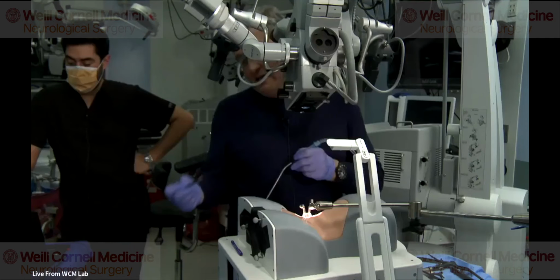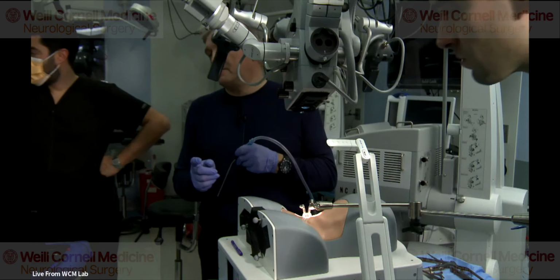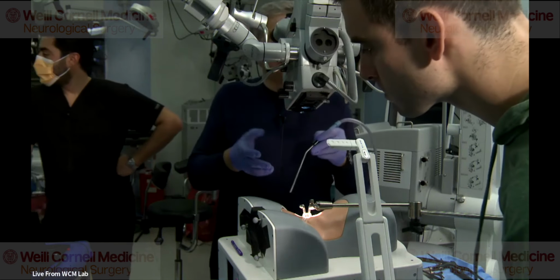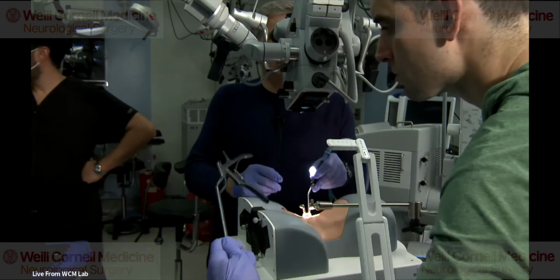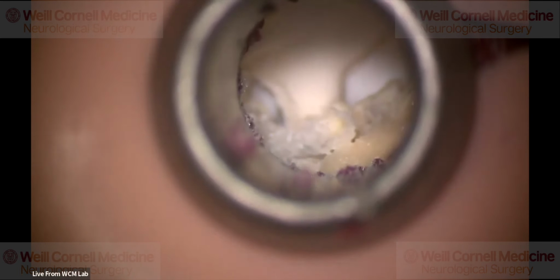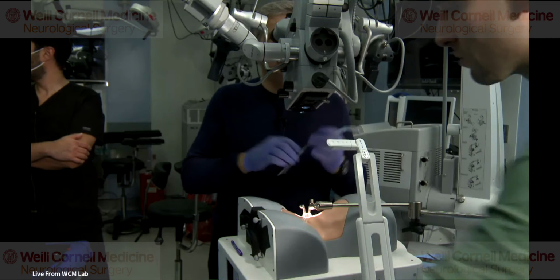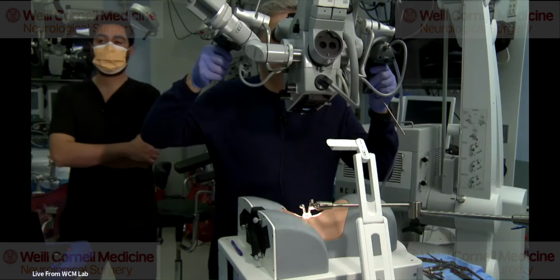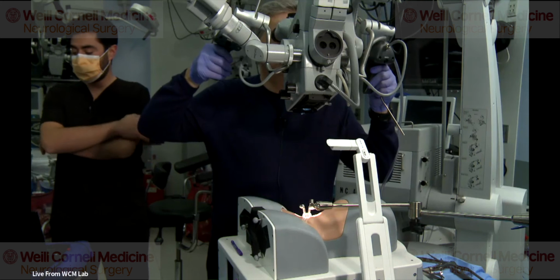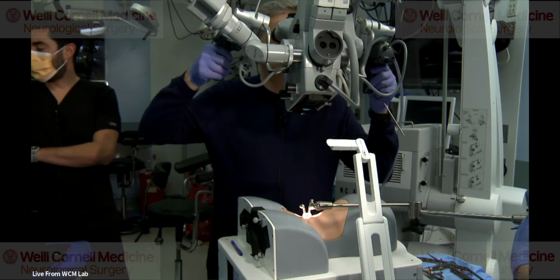And then, do we have a 1 millimeter Kerrison? I didn't ask for that before. We have it. And now to go lateral and really finish up the decompression, I use a 1 millimeter Kerrison because a 2 millimeter Kerrison can cause too much nerve compression, and you can develop problems in these patients, obviously, if you're not careful. So that's in focus for me, but then this is in focus for you, right?